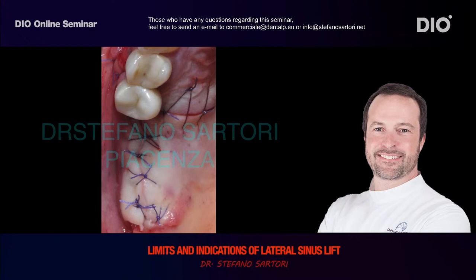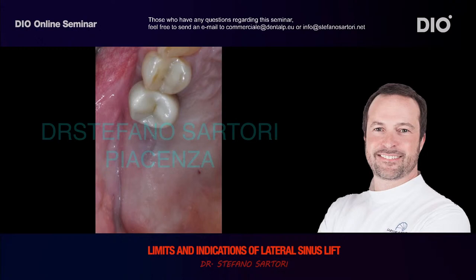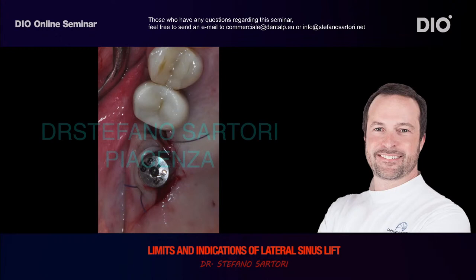The healing, and when we make the reopening, I want to show you the soft tissue management. The incision of the flap starts more palatal because I want to move a piece of keratinized soft tissue from palate to buccal plate, to buccal position. In this way, I can obtain a piece of keratinized tissue around the healing abutment, as you can see in this slide. And look after 1 week of healing in the next slide.